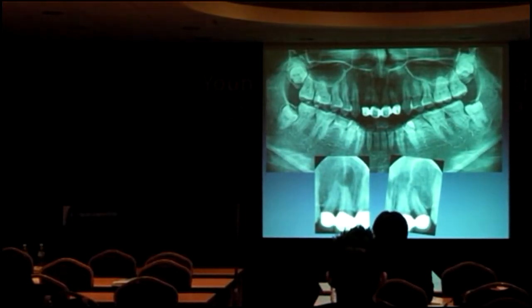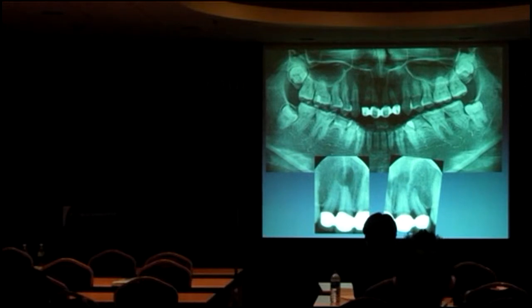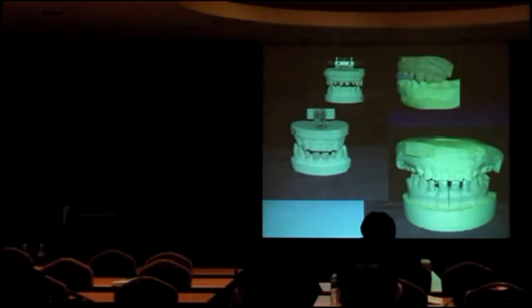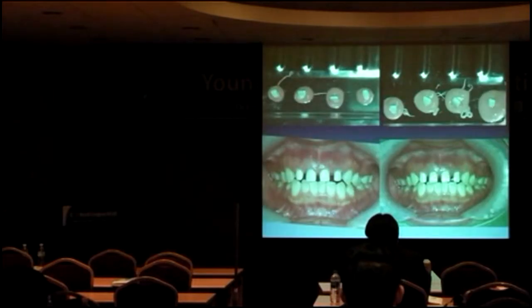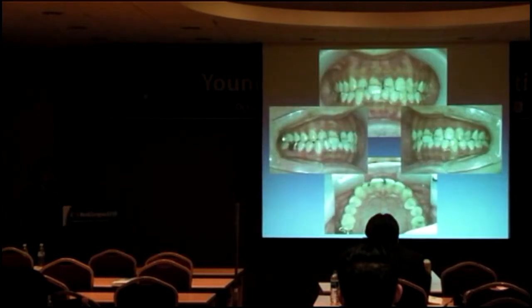And this is a multiple crown case, where multiple anterior crowns were splinted and had periapical lesions. I found the periapical lesions, so I finished the root canal treatment. Then I made an impression, and I scanned at the same time. I made eight individual copings, and I tried them in the patient's mouth and made a replica. This is the end of the treatment.